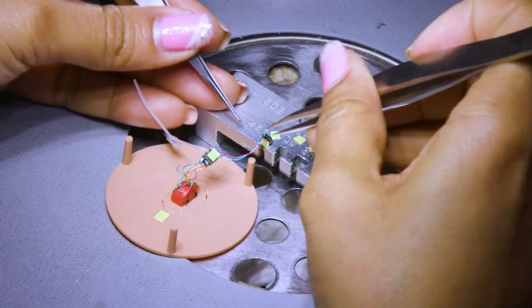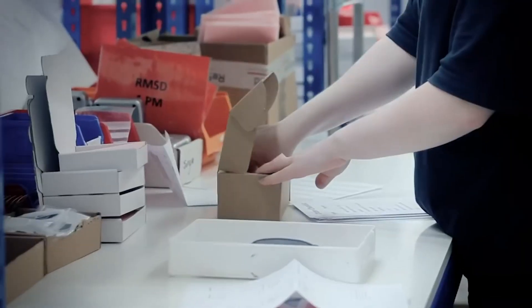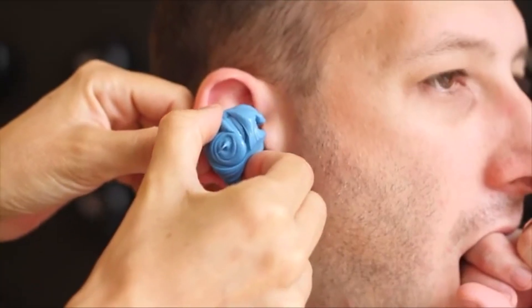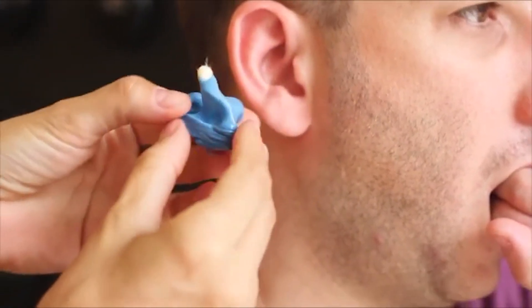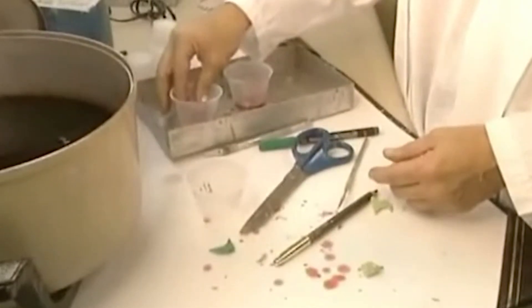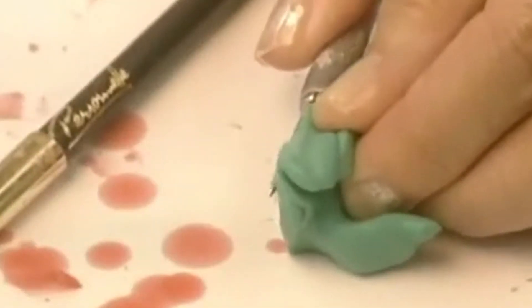Typically, an order card will be prepared and sent to the production line along with the ear impression. The jelly-like mass of silicone that was removed from the ear will be used to make a positive imprint. It is soaked in warm wax, forming a solid film over the impression, and then placed in a silicone cup. The cup is filled with silicone, which solidifies in only 10 minutes. The hardened silicone block is removed from the container, and then the silicone impression is removed from the block, leaving a positive imprint.